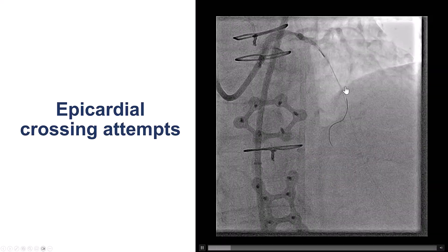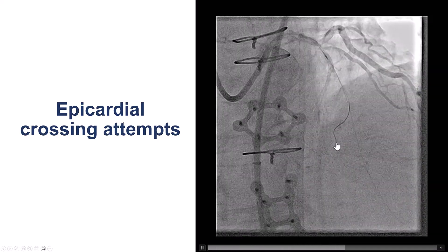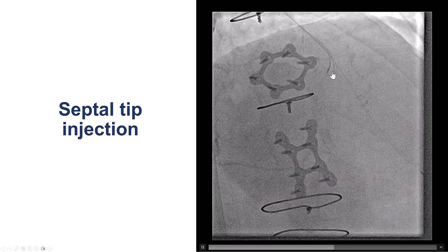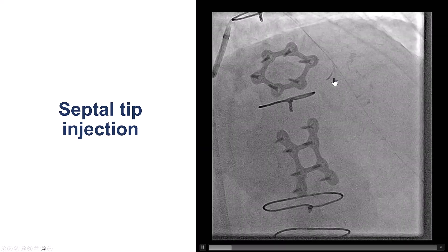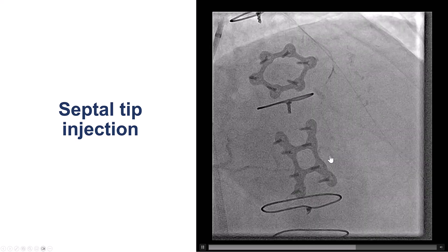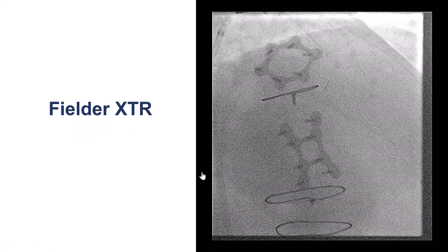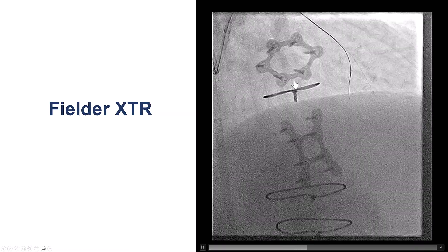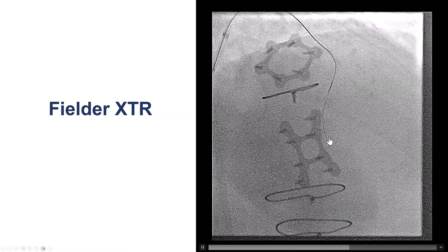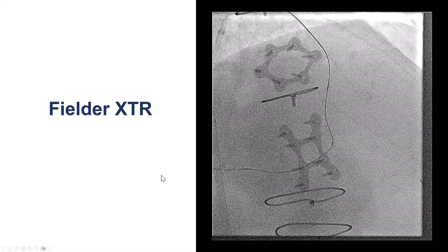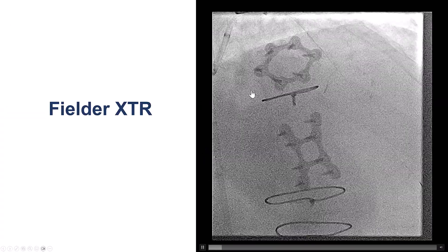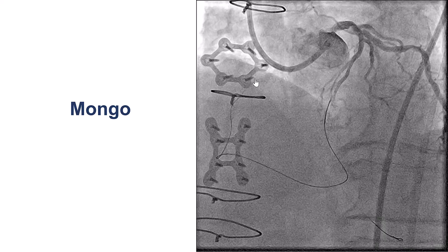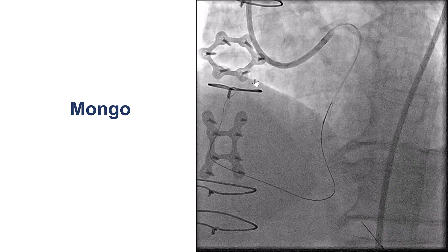Now we had some better flow, though still with comparative flow. We advanced the guidewire into what we thought was the second septal that seemed to have a continuous connection. To confirm, we delivered the Caravan and did a tip injection. Sure enough, we had flow going towards the apex, then turning towards the base and connecting with the PDA. We then took a Fielder XTR wire — a soft polymer-jacketed tapered tip wire — which went towards the apex and very nicely made the bend, going very easily into the distal right coronary artery and heading towards the proximal right. Literally, this was a within-seconds crossing, but it had taken several hours to reach this point.